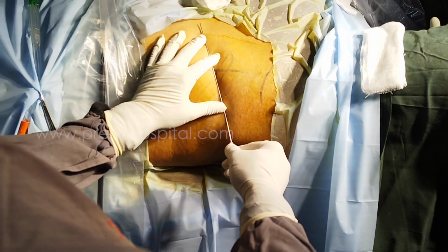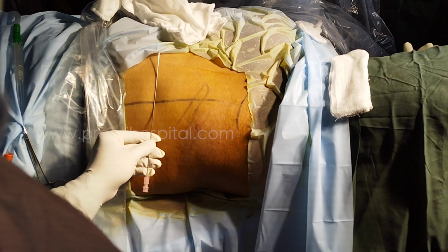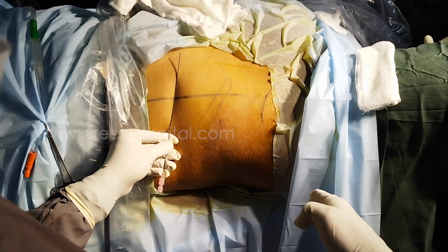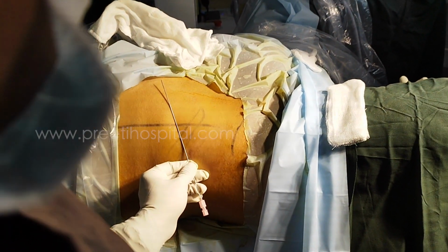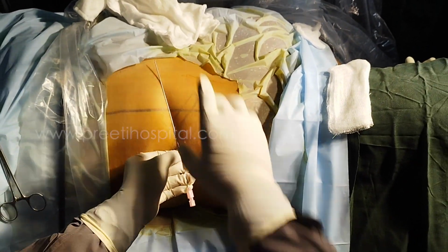This is the correct puncture. If you have doubt, the other puncture is like this. This will automatically go way above, because this angle is this side, this angle is this side. So I prefer this.